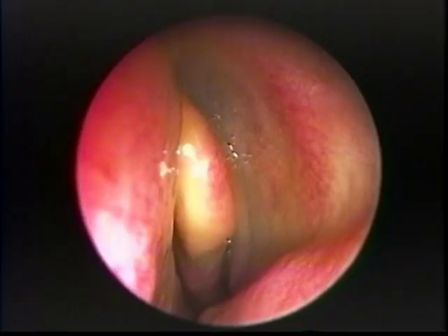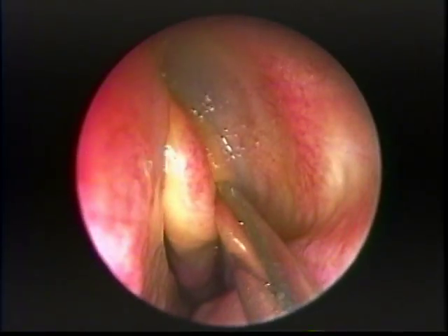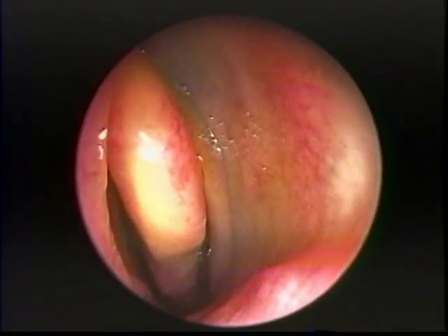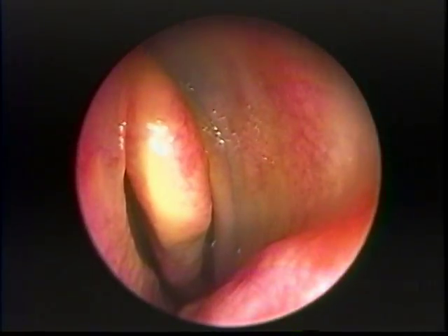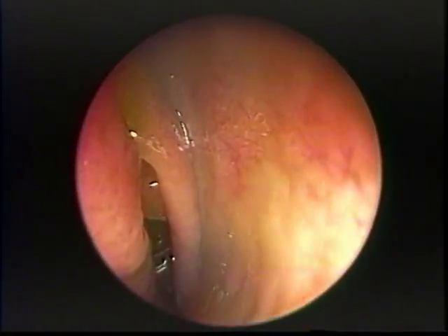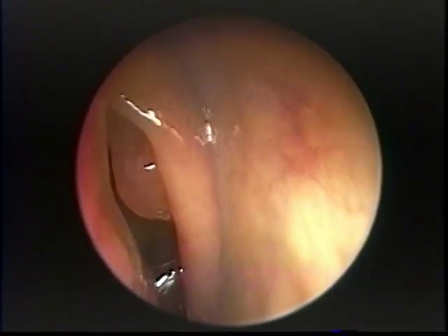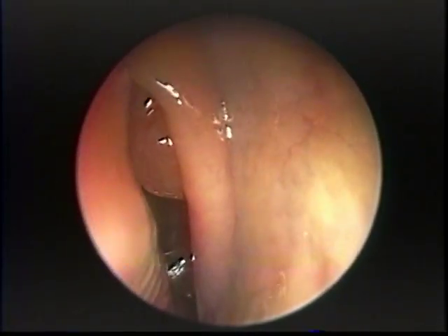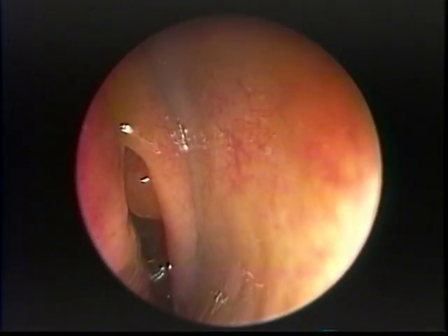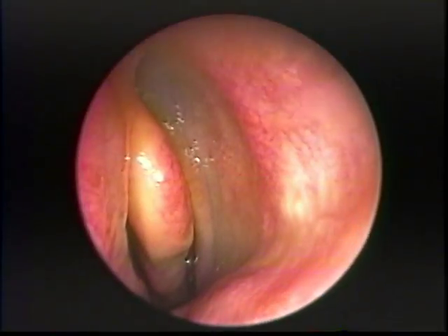On the left side, we have a medially bent uncinate process that appears almost edematous. The medial border of the uncinate process is actually rotated anteriorly — the so-called anterior bent uncinate process. What is peeking out between the middle turbinate and the uncinate process is either polypoid tissue arising from the ethmoidal bulla, or a small polyp, and we won't know until we resect the uncinate process.